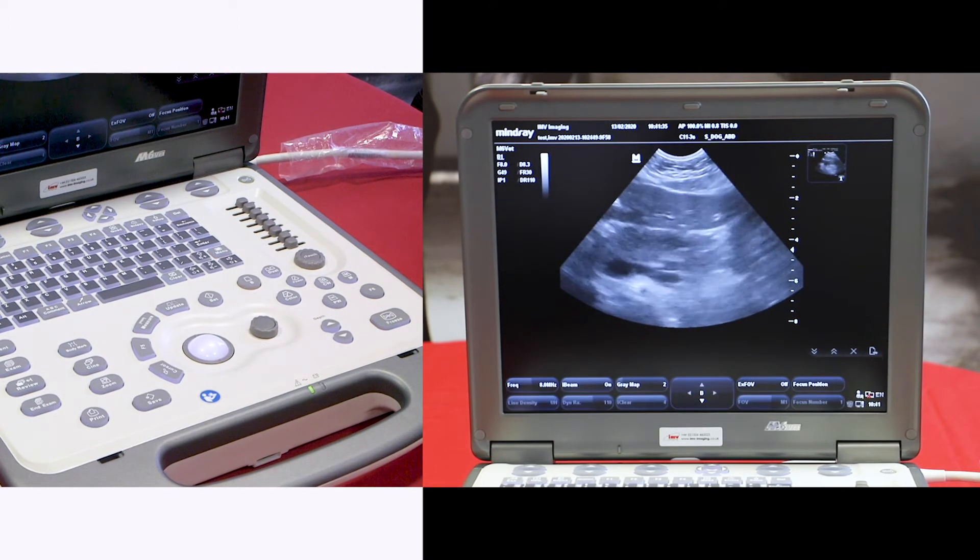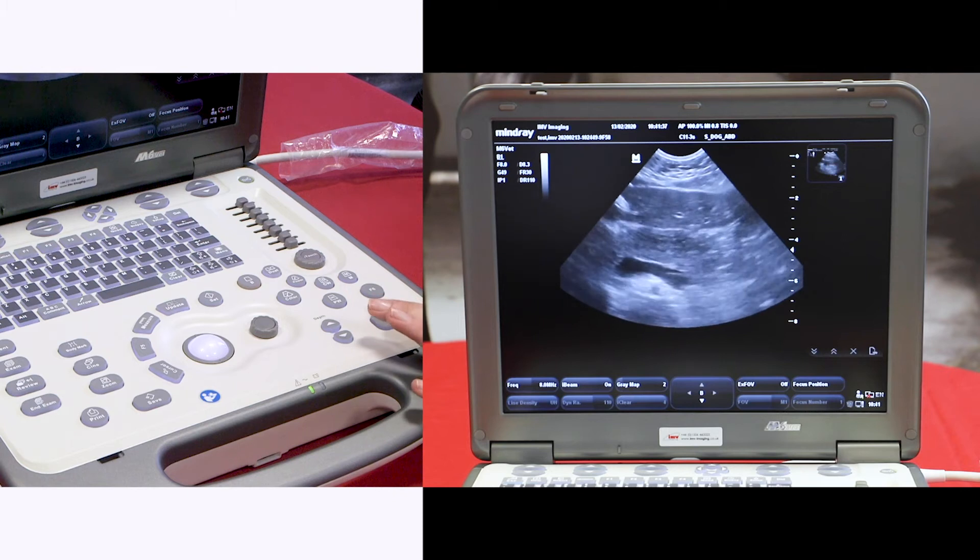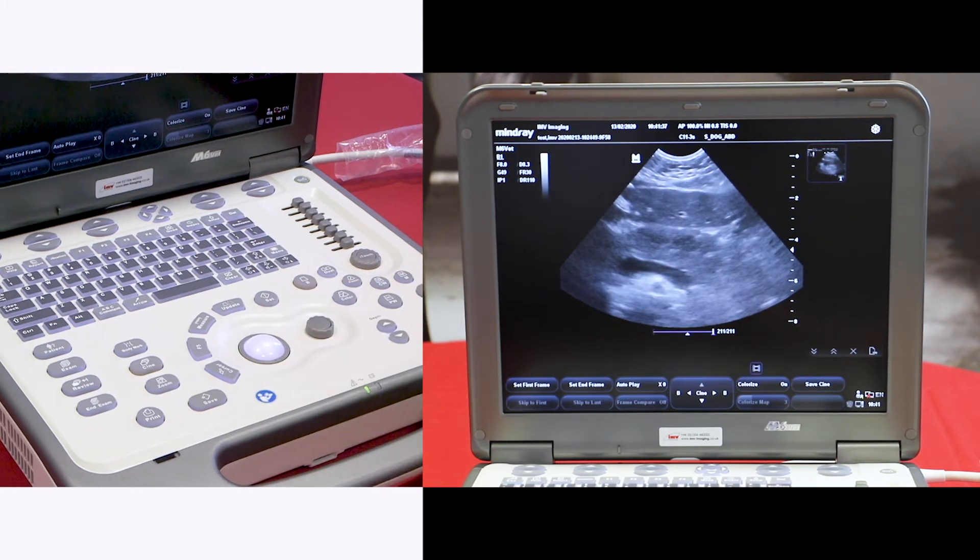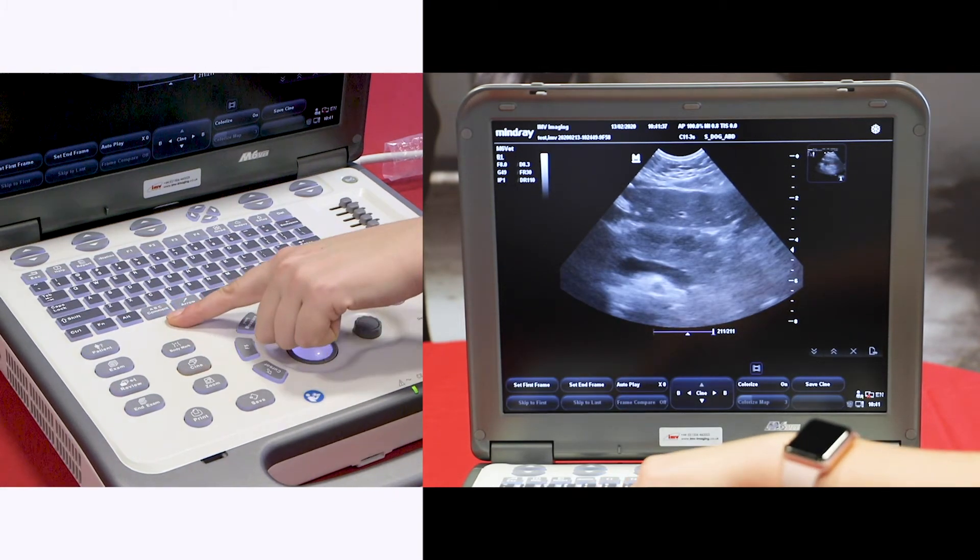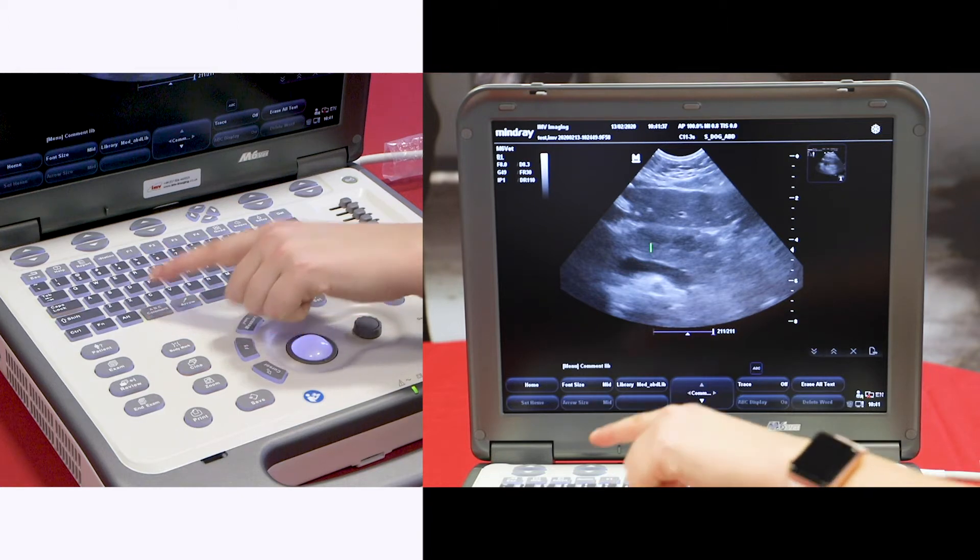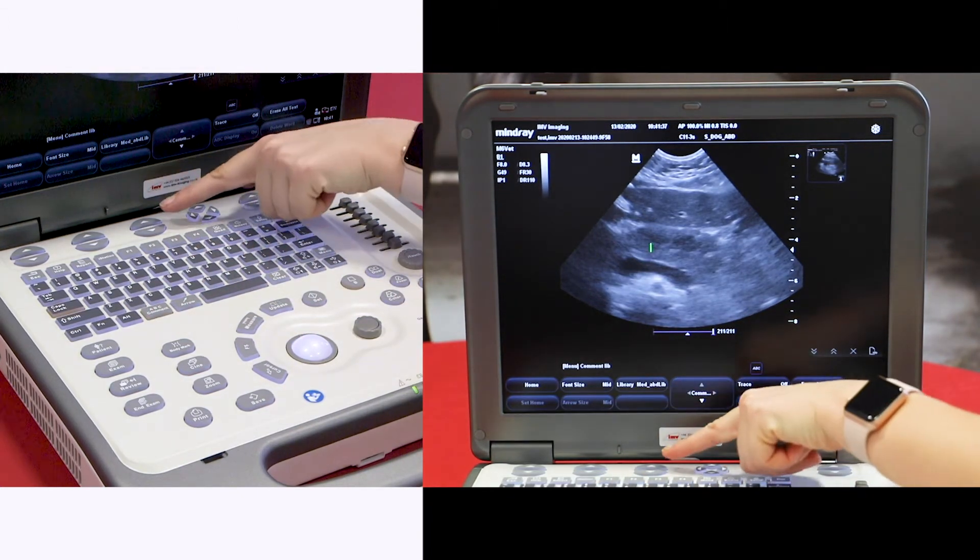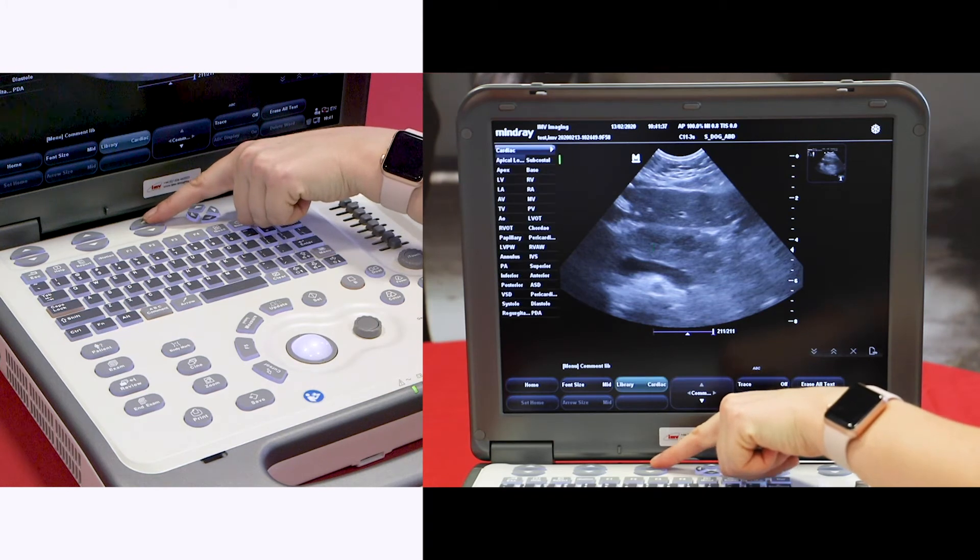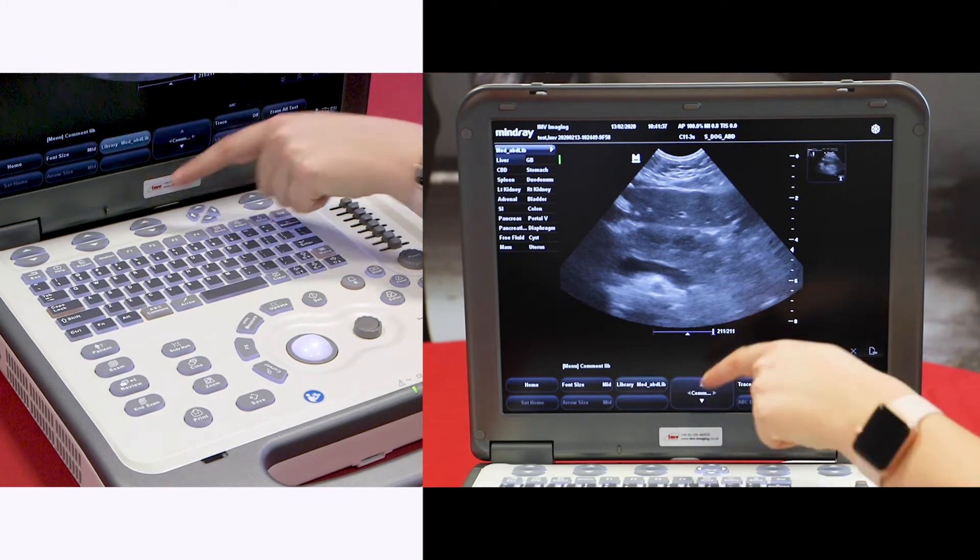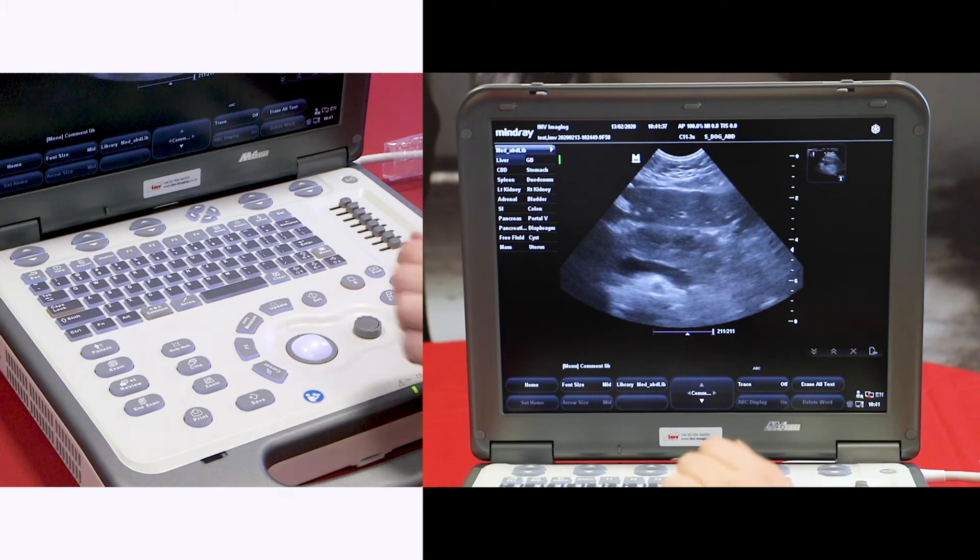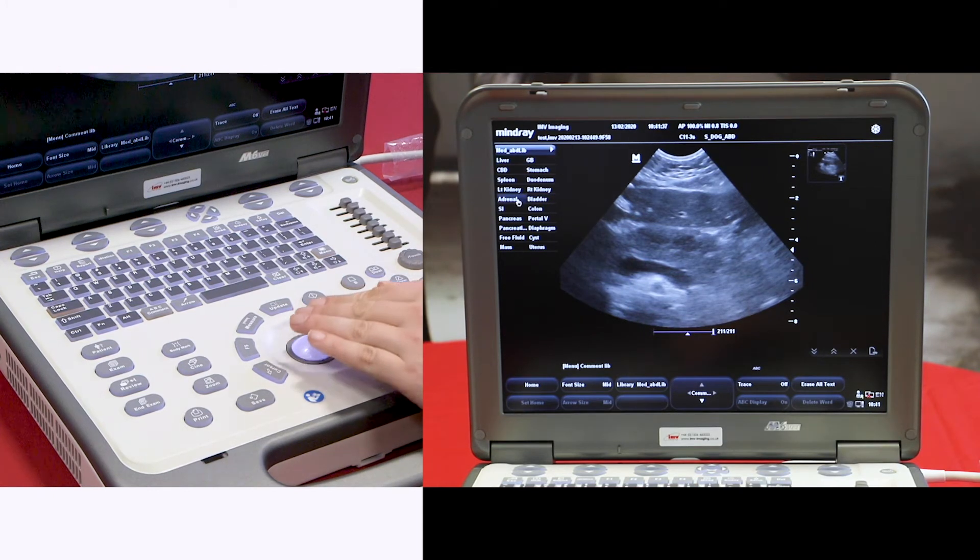To save an image with a comment, freeze your image. The comment button is just to the left of the spacebar. Press this, then pick from the different libraries. Scroll through until you find the appropriate one.